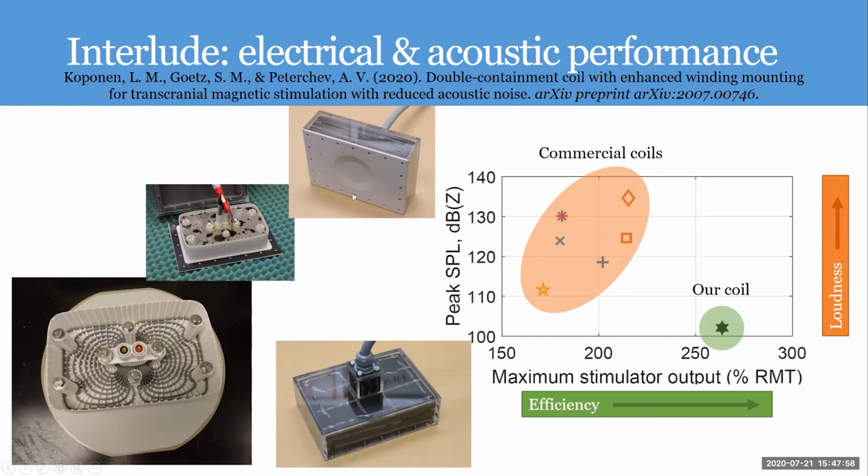I have a better design of this sound containing lid, and then a less bulky version of the outer sound containment in the manufacturing pipeline. So I'll be still doing a next optimization generation, and then hopefully getting to actually do experiments in some time scale with humans.